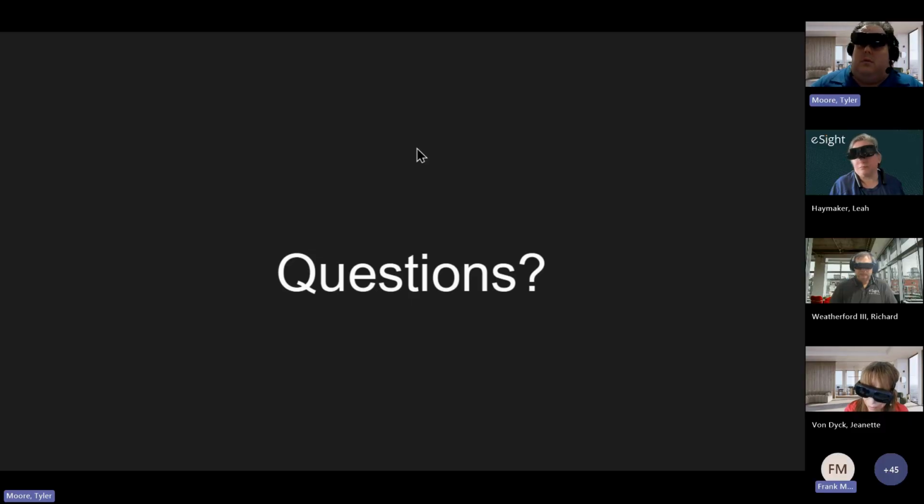But hey guys, this is Frank again. If I could ask another question, since I found my mute button. You were talking about when you go to a theater and watch a show, which I do, and how the colors get washed out with the bright lights of the stage. And you mentioned the contrast. What is the term that you use? Exposure. Is exposure like a menu item? Not like we have zoom, tilt, contrast. Is exposure going to be an item now on the menu in 5.03, or is that automatic?